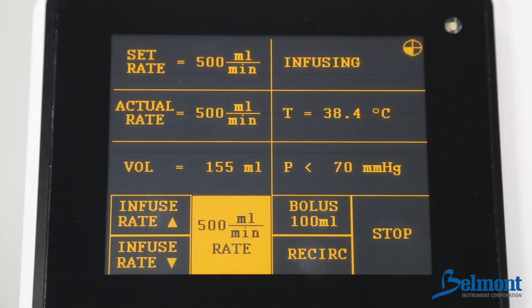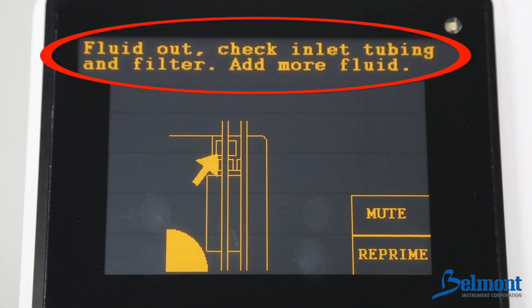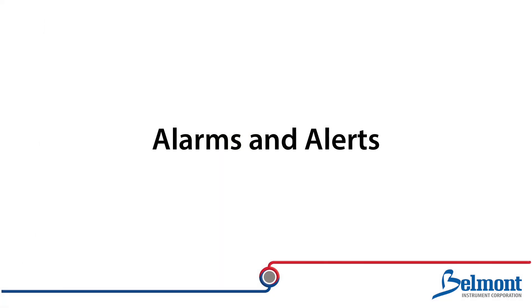The Belmont Rapid Infuser RI2 will alert the user with an audible alarm if it senses a problem and will display instructions for corrective measures. To silence the alarm and return to normal operation, simply follow the instructions on the display. Here are some troubleshooting tips for the alarms you might experience.